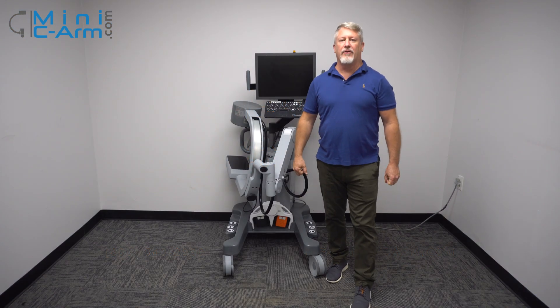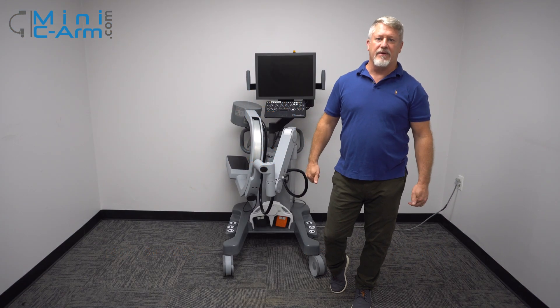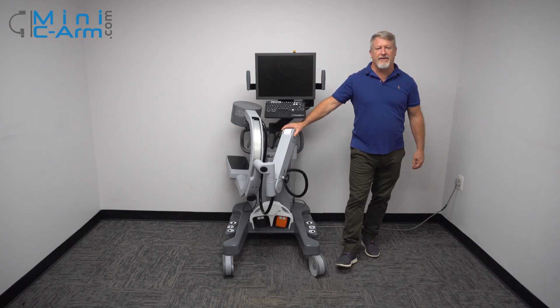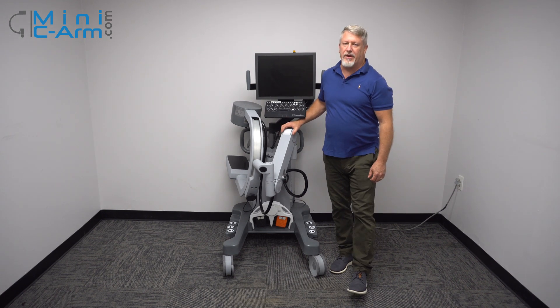Hey guys, I'm Christopher Bacon, the founder of OrthoScan and the president of MiniSearm.com. Today we're going to go over the OrthoScan FD, which is their first flat panel system.